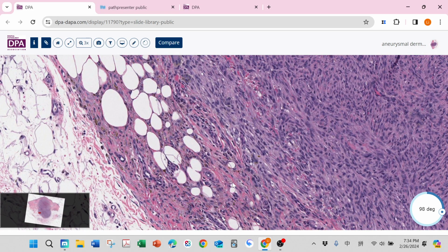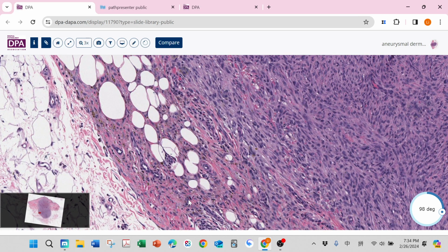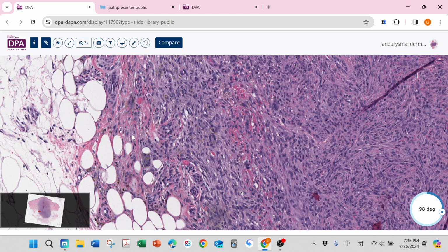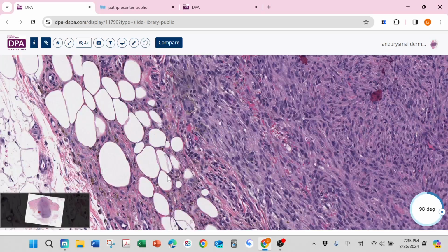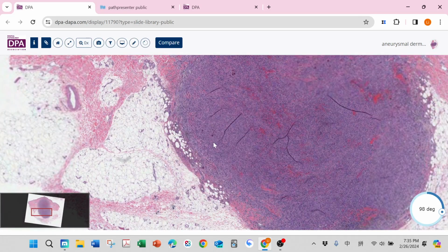You can see these different shades and sizes of the fat. They also have this inflammatory reaction. You can see lymphocytes, even other inflammatory cells around this collagen, this fat trapping. Not like DFSP, where the fat is kind of happy to be surrounded by the DFSP, so you won't really see this kind of big-size adipocyte, small-size, and then inflammatory infiltration around the fat.